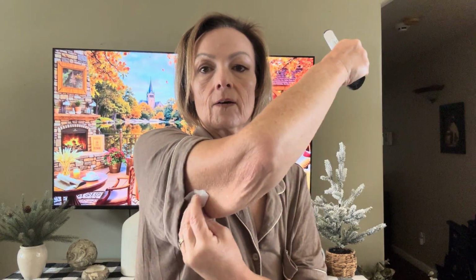So I'm taking an alcohol swab, and we're going to start at the inner circle and work out. Sorry guys, so instead of having fatty arms, I have flabby arms now. You know what, and that's okay. Which kind of makes it a little bit hard, making sure I don't touch it. So thank you. I had a comment last week, start from an inner circle and work your way out. So it's a little bit awkward when doing it like this, but I know that way we're not infecting that area or bringing in germs.